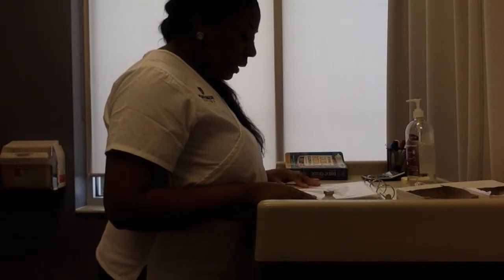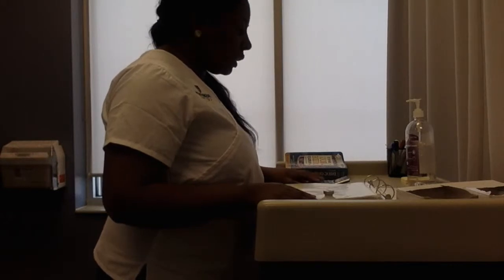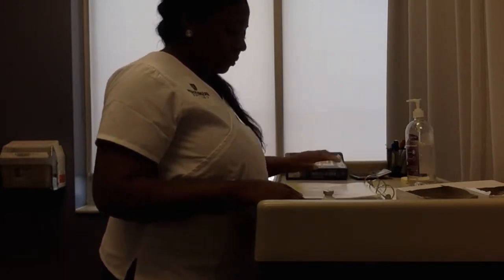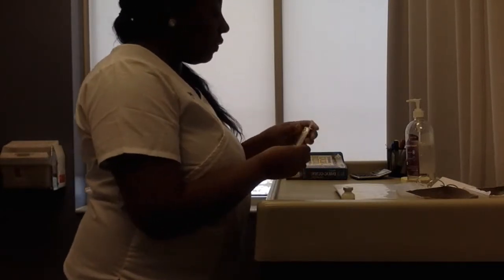Alright, so being that it's in micrograms, I want to do a drug conversion to switch it over to milligrams. So it looks like I will give 2 milliliters of my naloxone. Prep my bottle. I'm going to open up my supplies in a sterile fashion.